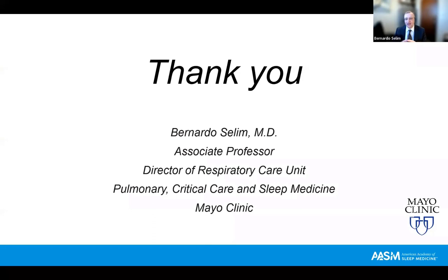How did this alveolar ventilation calculation come about? It is literally a paper from the 1970s, with 10 or 15 normal recruited individuals in whom they calculated the dead space. They derived a formula, and that is how this machine and this brand calculate alveolar ventilation. Raise your hand, how many of your patients are normal, healthy individuals? None of them. All of them may have some respiratory issues. For example, you can have COPD with increased dead space from emphysematous disease. So you need to make this patient taller, and when you make your patient taller, the alveolar ventilation will be recalculated. So I do agree with the comment, Divya, that you made, because you may sometimes need to readjust it, because remember, these formulas come from healthy individuals.